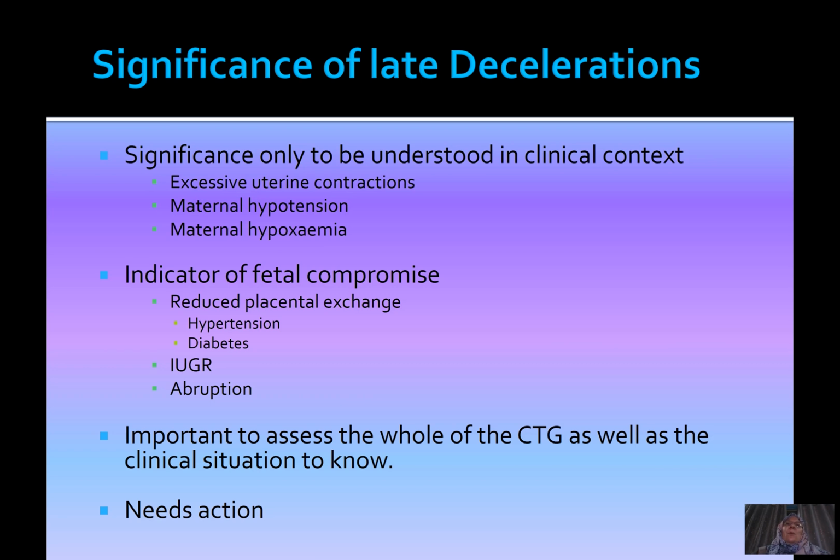So it is very important to assess the whole of the CTG as well as the clinical situation when looking at the significance of late decelerations, but they do need action. Okay, when you see late decelerations, you cannot say, we'll wait another 30 minutes. You have to make a detailed plan on how to manage this patient.